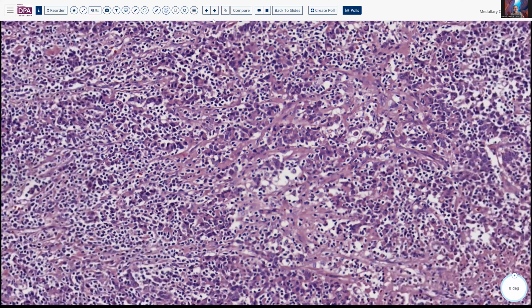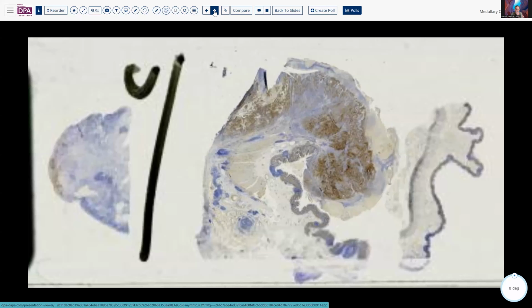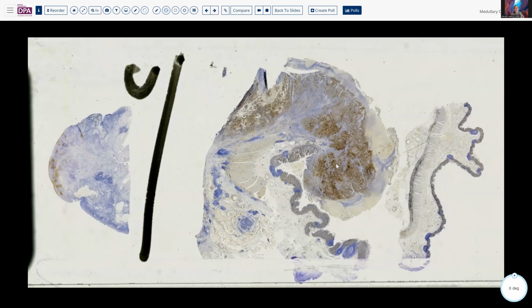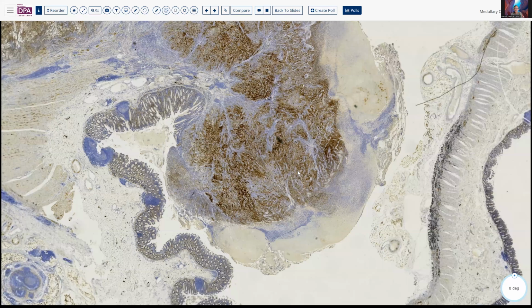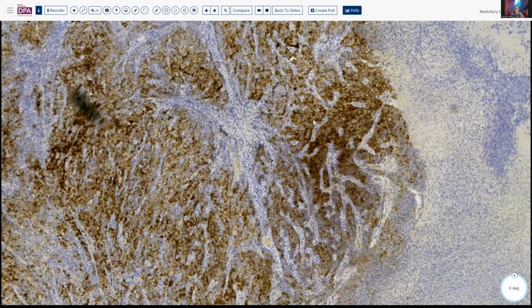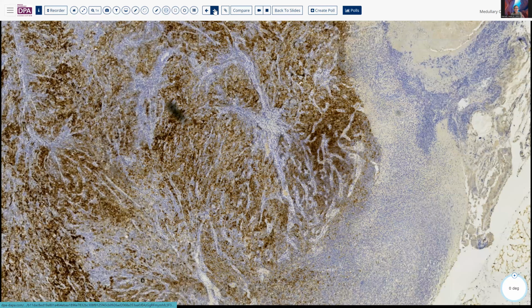Now, immunohistochemical markers are oftentimes a stumbling block for this tumor because we throw some keratins on it. We maybe do CK7, CK20, and it may turn out very likely to be negative in most cases. A small percentage of these tumors are positive. However, when we do a calretinin stain, this is what we see. So this is a nice positive calretinin staining, whereas the keratins were negative. And also the CDX2 was negative, as is often the case in this tumor.